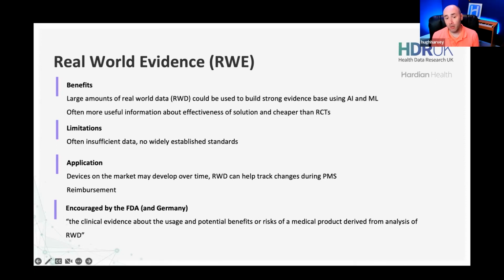So the best way to determine it would probably be to include in your documentation annual review at a minimum, to ask yourselves the question, is it time to update or remove this version of the device from market and get a repeat regulatory submission for an improved version of our algorithm or product. So there is no strict set in stone lifetime of a medical device, though the only caveat to that is the lifetime of a device is defined as the lifetime of which it is on market.